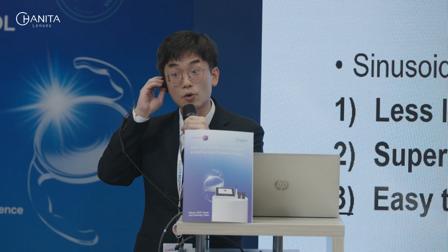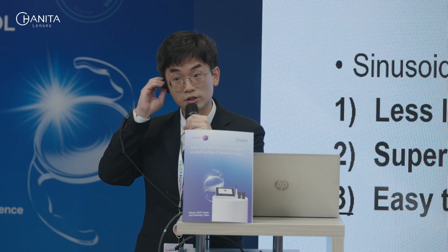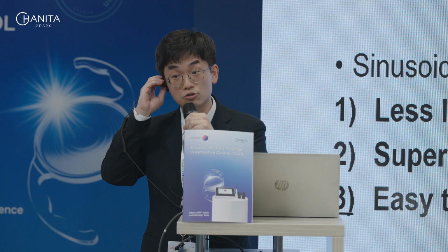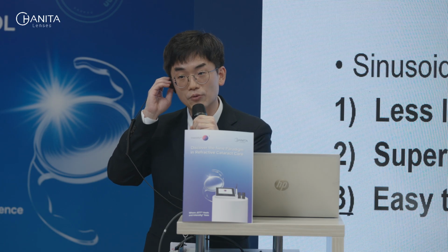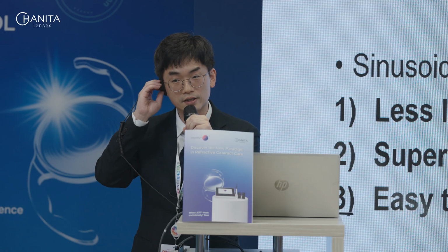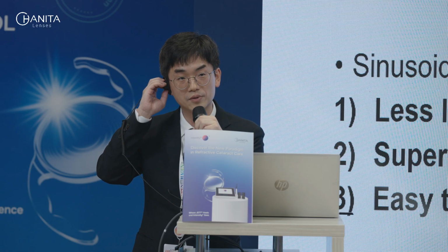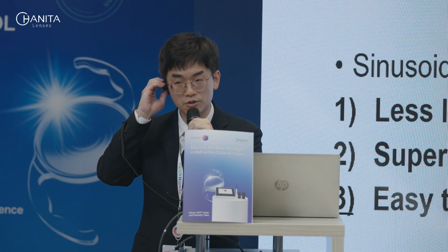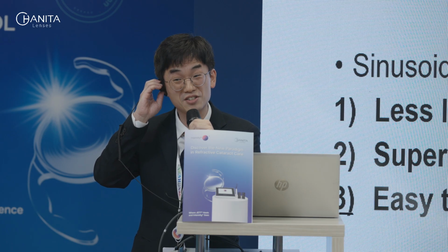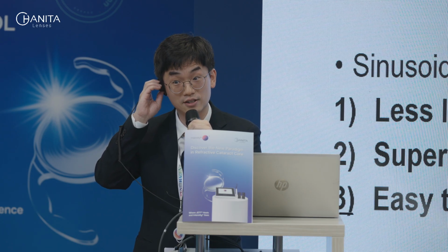So it is okay to use because the zero order doesn't induce any chromatic aberration. So you can usually trust your AR with the conventional diffractive designs. But with this one, as I told you, the chromatic aberration affects the AR results. So it is very unique compared to other designs.